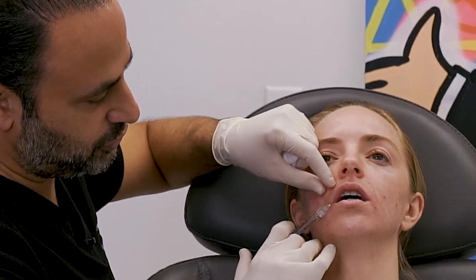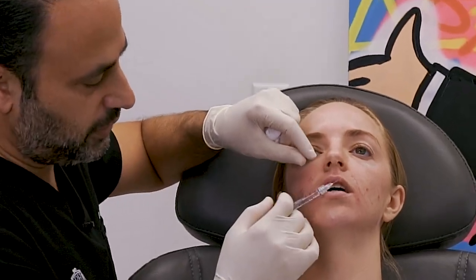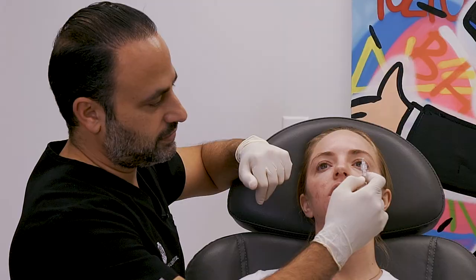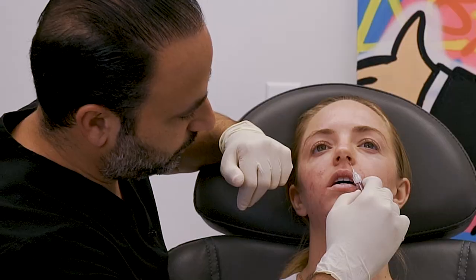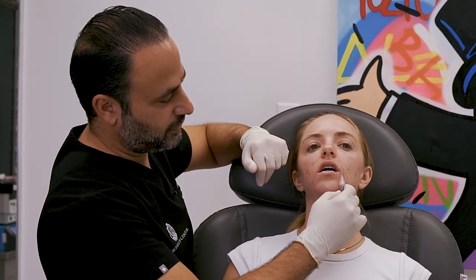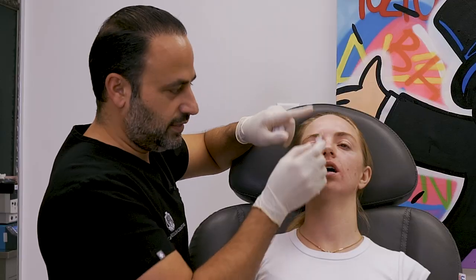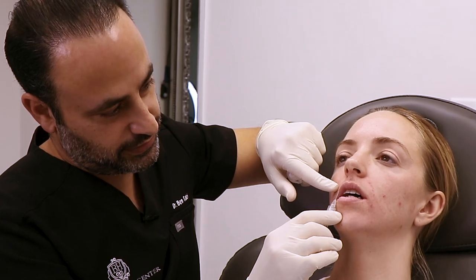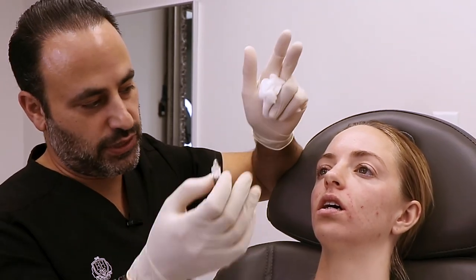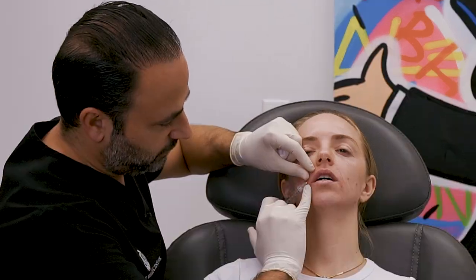I want to add a little volume here to push down, and a little more here to push forward and down — looking at her from two vectors: outwards and downwards — and not do much in the middle. The lip has two parts: the sub-nasal lip under the nose and the sub-facial lip under the face, separated by a diagonal line from inside the sill down. Everything medial is sub-nasal lip; everything lateral is sub-facial lip. When you inject medially in the sub-nasal lip where the vermilion border is strong, you get eversion and can actually lift upwards. Lateral to that diagonal line, you cannot lift this no matter what — you'll only make it heavier. So we're dropping it to get more exposure.